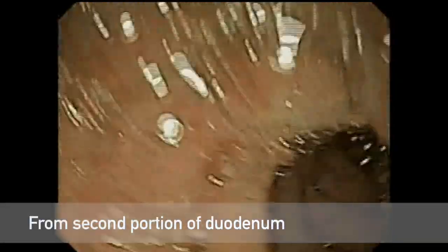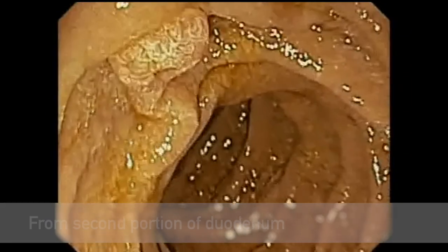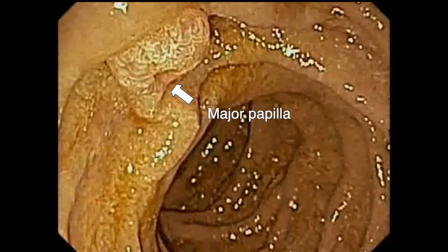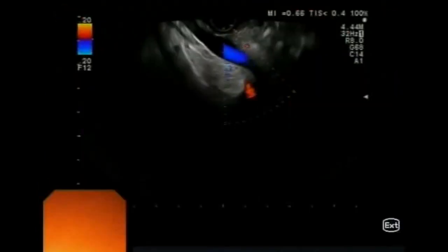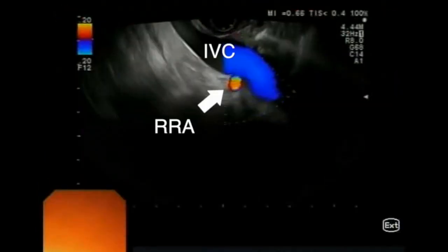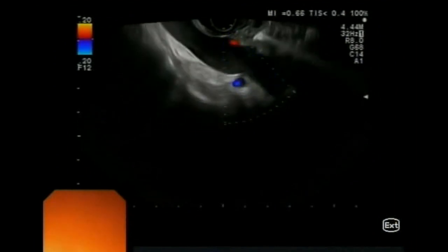To study the uncinate process, we advance the scope into the second portion of the duodenum and withdraw slowly under endoscopic guidance until we see the major papilla. The up-down wheel is moved up and we gently torque clockwise and counterclockwise while slowly withdrawing the scope as needed to see the IVC close to the transducer and the right renal artery below, as confirmed by the Doppler signal.